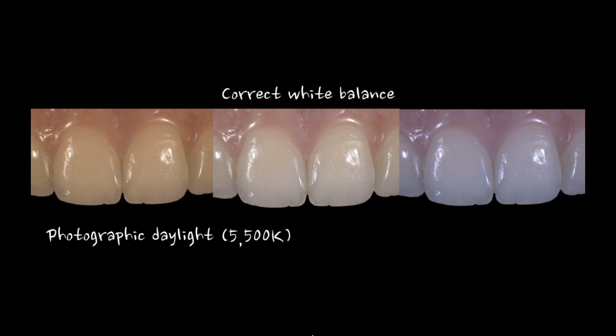If it's a very old camera and it has very low megapixels, you may not even have some of those settings in the camera. But any camera today of merit that you bought in the last 3-4 years should have all those things in there. Why is the white balance important?